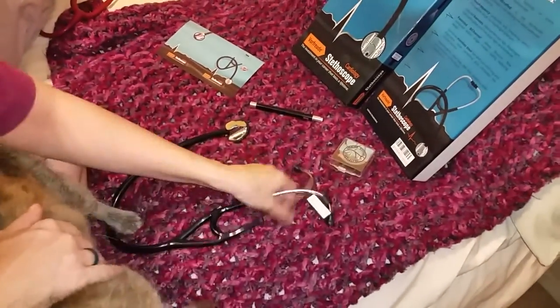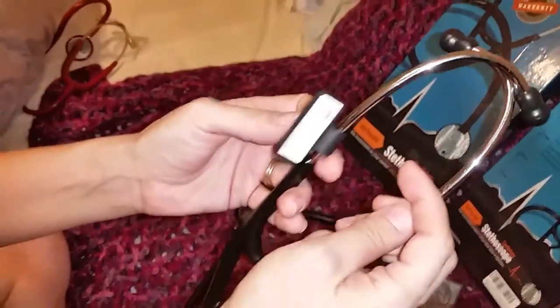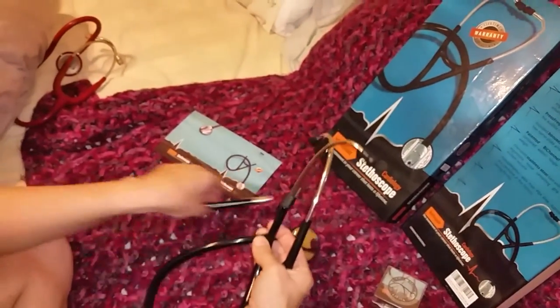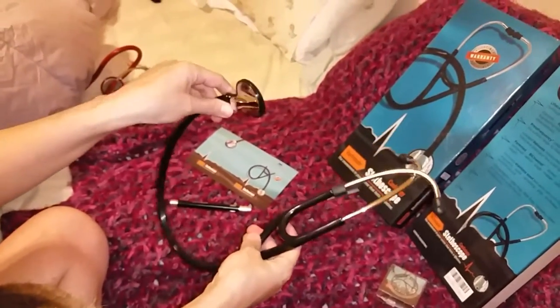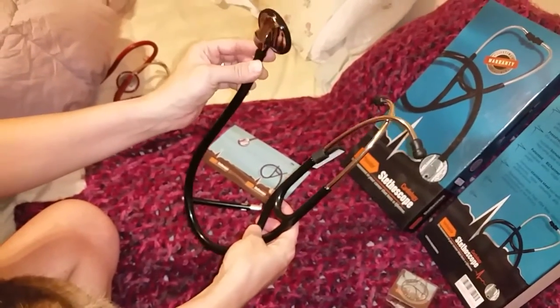The case slides over so it locks. The stethoscope does have a name tag on it — you must take it off if you don't want it, or if you have one that you use yourself. This is hypoallergenic, stainless steel, PVA free, latex free, and it is sterilized in the factory.